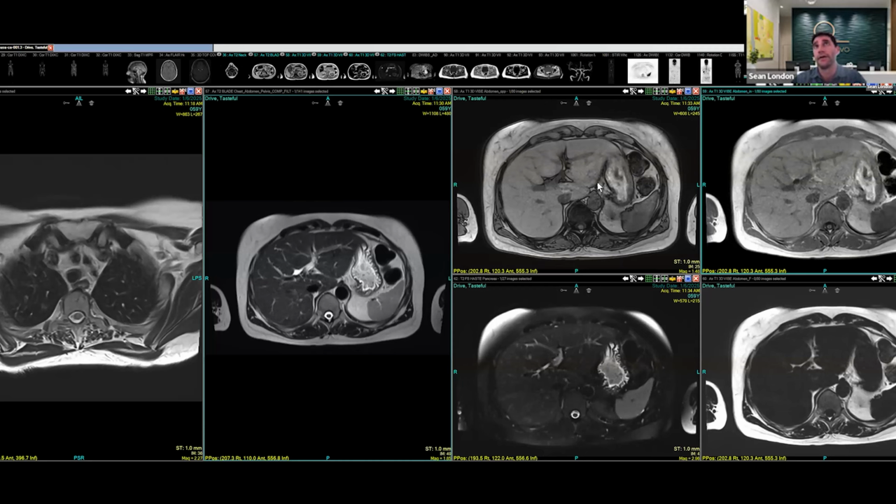within the liver. The most common one we see is fatty liver, just generally related to our culture, drinking, bad diets. But the good thing is that it's modifiable and reversible most of the time. So knowing about this early is a good thing, and then we can follow up and see if we have any change within the liver just based off lifestyle modifications.